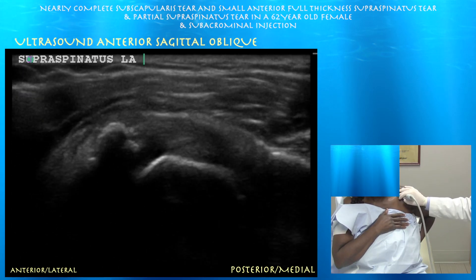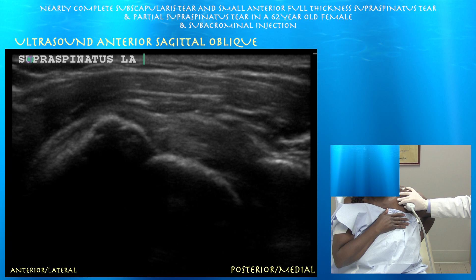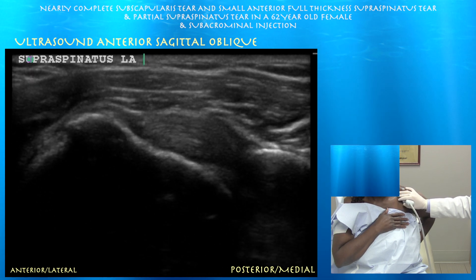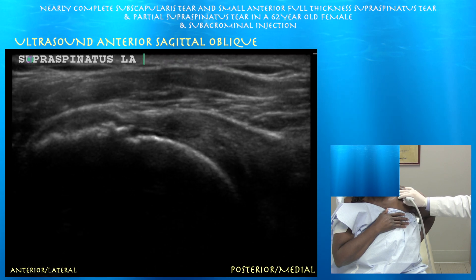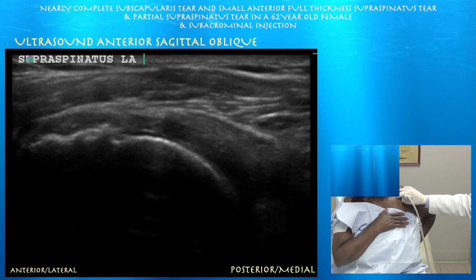Here's our superior facet of the greater tuberosity. You can see the biceps tendon, which marks the very anterior distal aspect of the supraspinatus tendon. You can appreciate a convex superior facet of the greater tuberosity, and this facet marks where the anterior aspect of the supraspinatus tendon inserts. Here's a distal anterior full-thickness tear of the supraspinatus tendon — a black zone with well-delineated margins that does not go away when toggling the probe, confirming it is a full-thickness tear. Just proximal to this, you can see a thin oblique line consistent with a partial articular-sided tear as well.